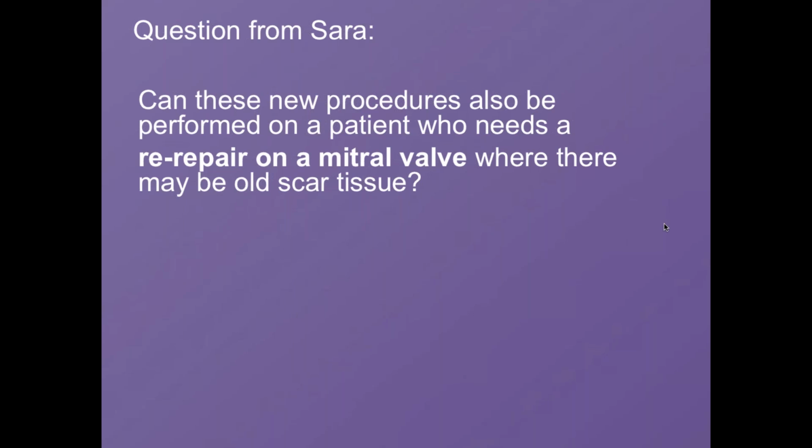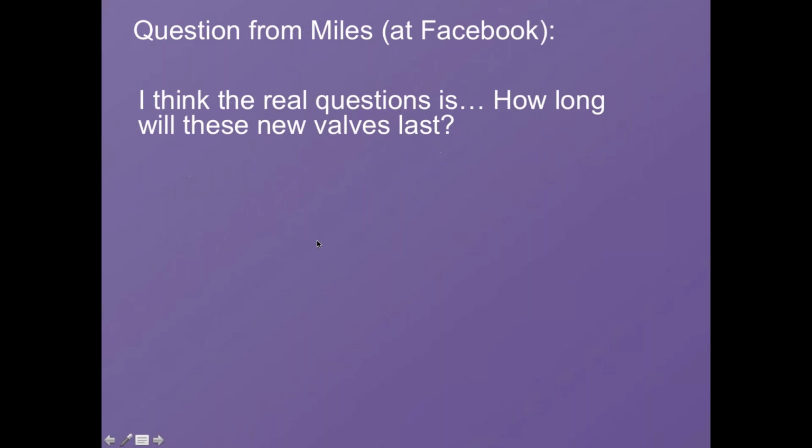There was some interruption. So the TAVR was really sort of the last 10 years as that rapidly developed. The next 10 years, you'll actually see or hear about a lot more developments in mitral surgery, but it's still pretty early for transcatheter treatment of mitral valves. But theoretically, for some patients, this is definitely a possibility instead of a second operation. Great. I hope that helped you, Sara. And let's move on. A question from Miles over on Facebook, and this was echoed by some folks here who have submitted questions: I think the real question is, how long will these new valves last?